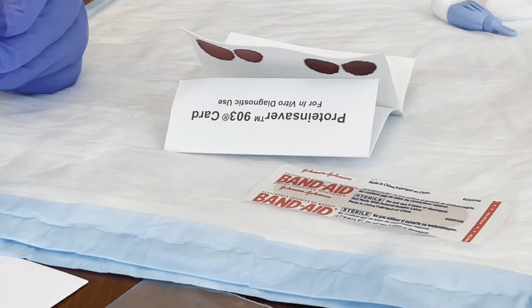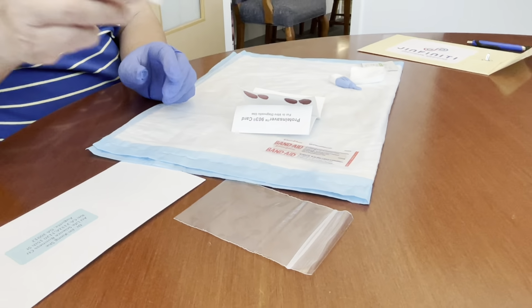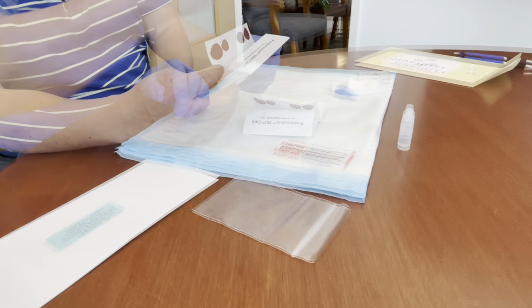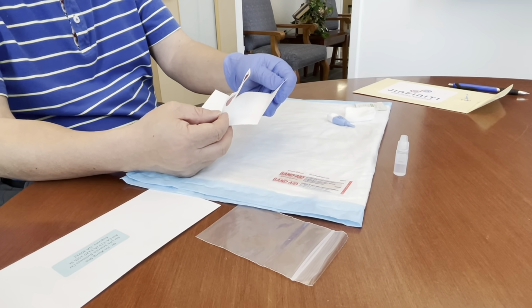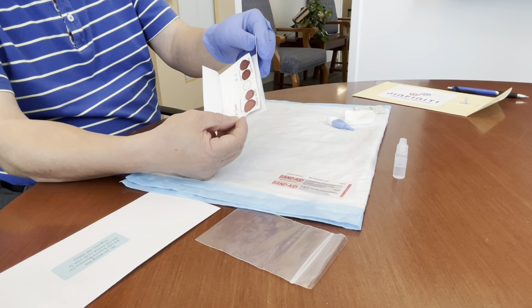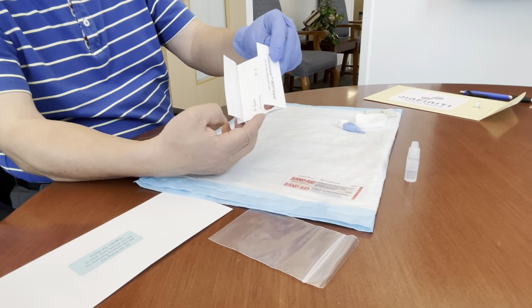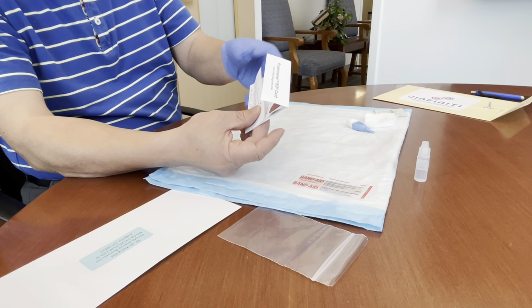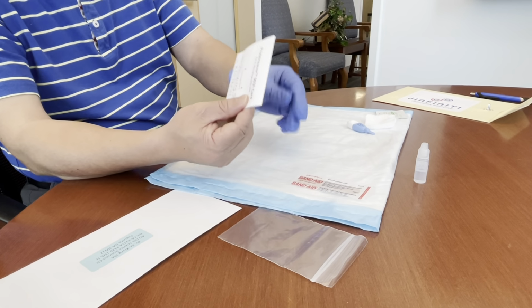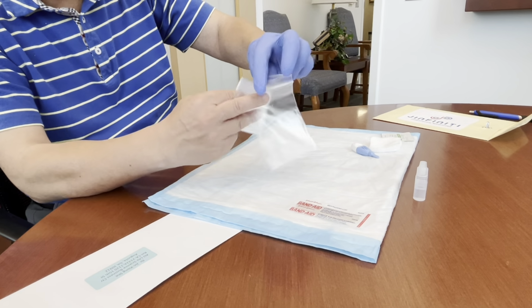Allow the card to air dry for about 5 minutes. You may cap and discard the remaining buffer in your household trash. After 5 minutes, fold the top flap of the card over the spots as a cover. Fold up the bottom flap of the card as well. Place the filter paper card into the plastic bag and seal it.